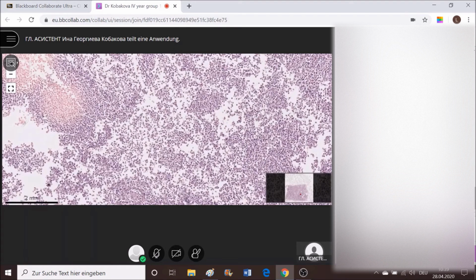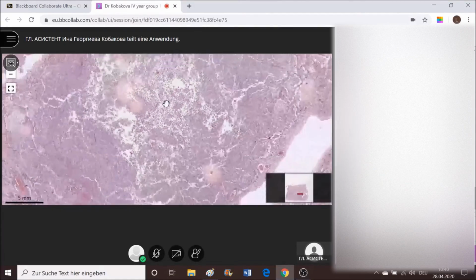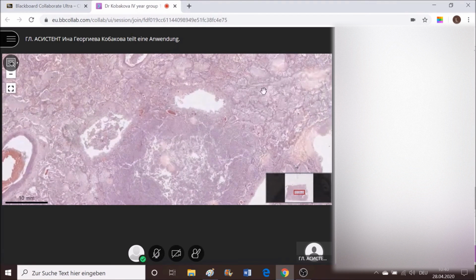It has a small demarcation of inflammatory cells. The chronic one has a well seen demarcation in the form of a pyogenic membrane. It's something that you should remember from general pathology. And if you don't remember it, read it again. I'm going to give hints on what the professor is going to ask about the slides.